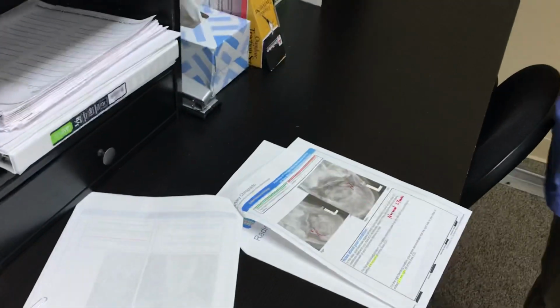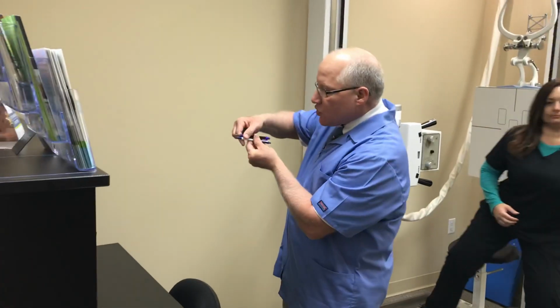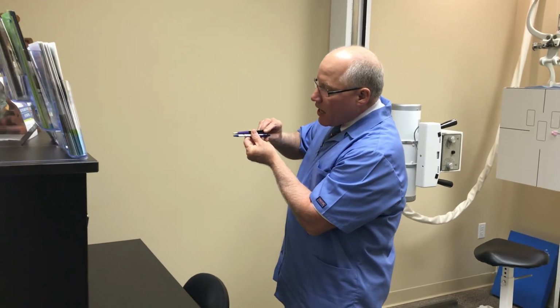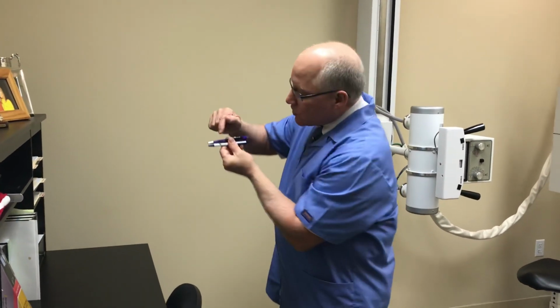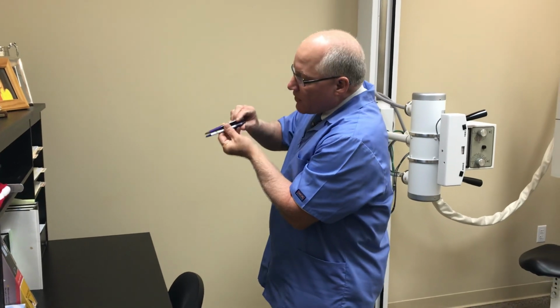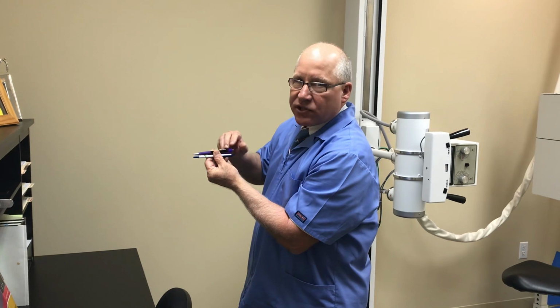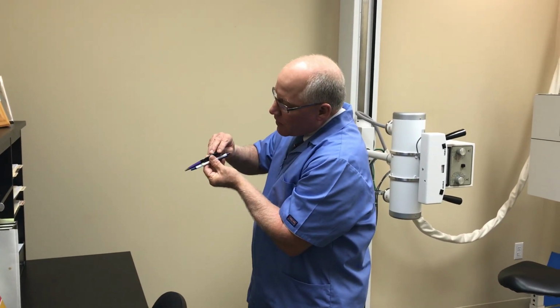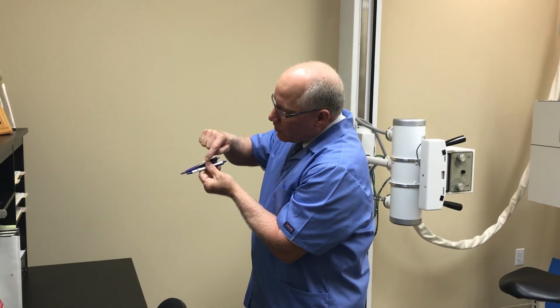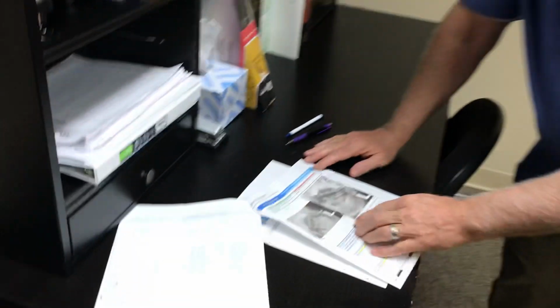And first, let me show you some biomechanics of the spine. Normally, when we look at the spine, if you tip your head, the bone should stay one over the top of the other. So I'm going like this, and we're looking at C1 and C2. They should stay one on top of the other. That's a sign of a healthy alar and accessory ligament. If they slide as you tip, that's a sign of damage to the alar and accessory ligament. So let's look at some x-rays now.